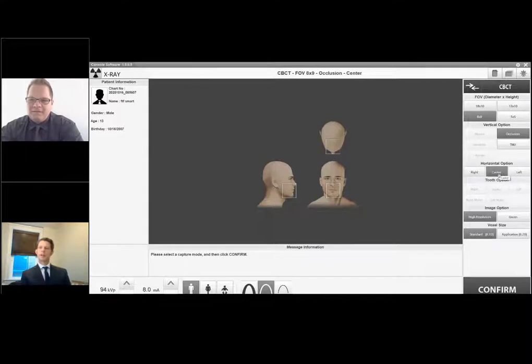Paul, you pointed this out on the right, center, and left. On center, you talked about capturing generally second molars forward, depending on patient facial features. I do have a lot of options. Well, I just want to capture right side or left side. So if I do right, it'll get midline over to the right side, and that usually will capture your thirds.